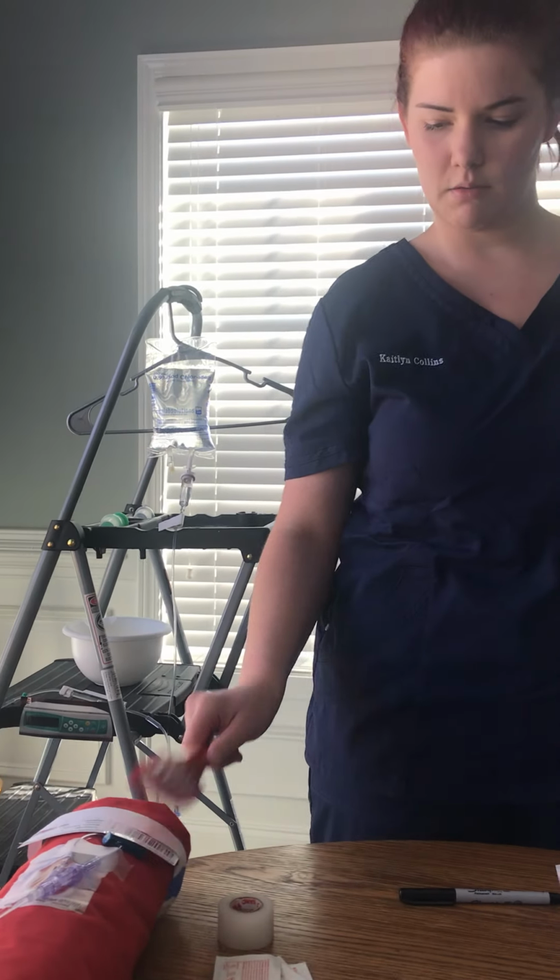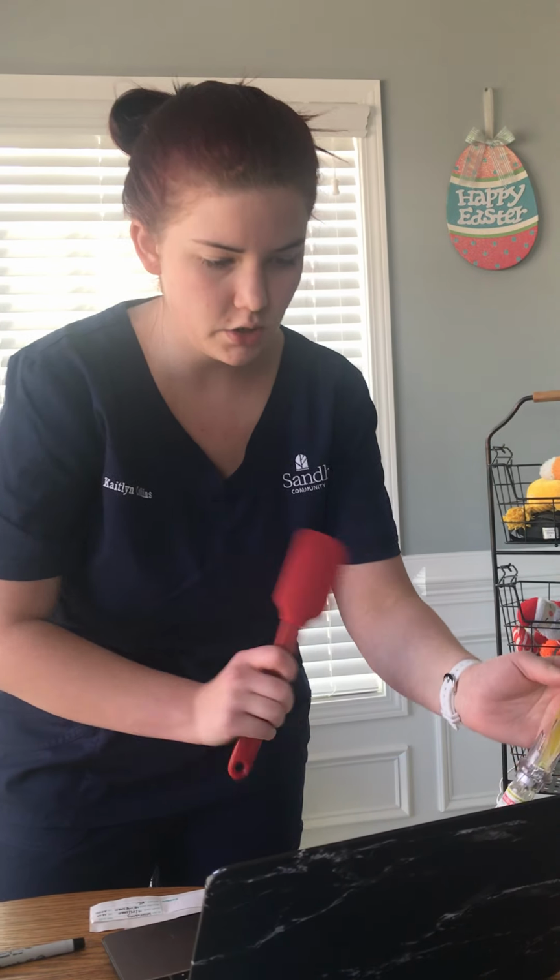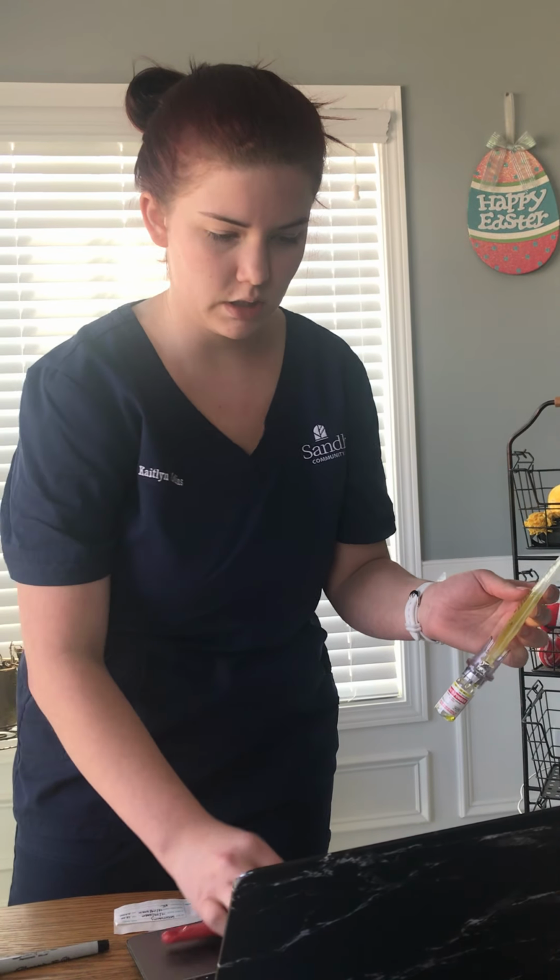All right, and can you tell me your name and date of birth one more time? Scanning my patient, 214XX, thank you. That matches, and then I'm scanning my medication barcode, and that matches.